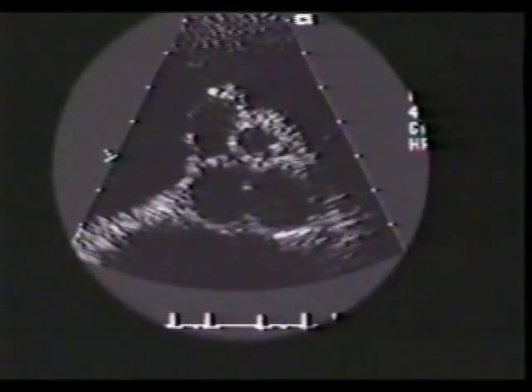More commonly, aneurysm of membranous septum is discovered as an incidental finding, as was the case in this 77-year-old female. We are looking at the magnified short axis view of aorta. Here is moderate size aneurysm of the membranous septum present. This is the right, left, and non-coronary sinus. You can see this clearly in real time.